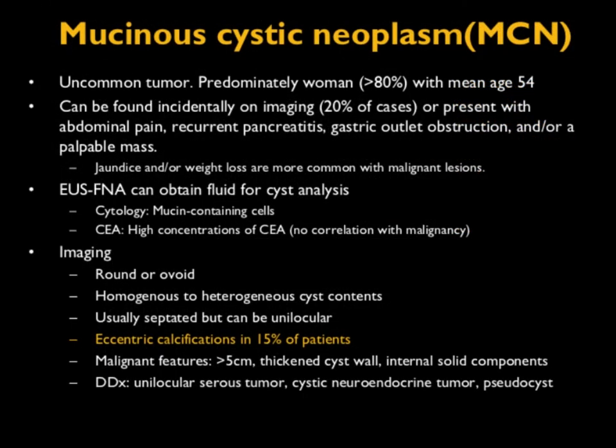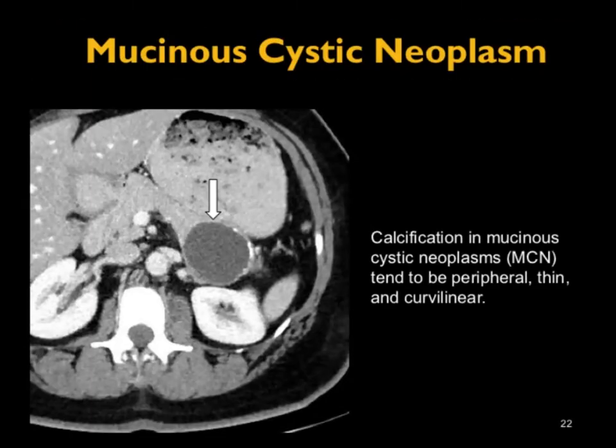Another tumor to mention is MCN — mucinous cystic neoplasm. These are classic: SPEN occurs in younger females; MCNs occur in middle-aged females, average age 54. Typically a cystic lesion in the tail or body-tail junction, usually an incidental finding. These lesions often have peripheral calcification. MCNs are challenging because a small percent can become malignant, related to lesion size and nodular components. Here's a good example — peripheral calcification in the tail.